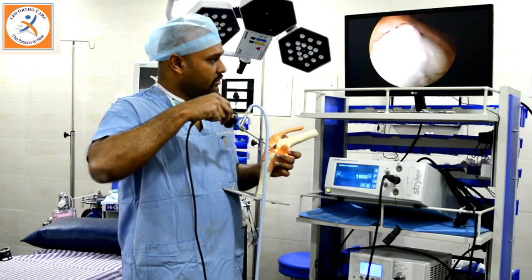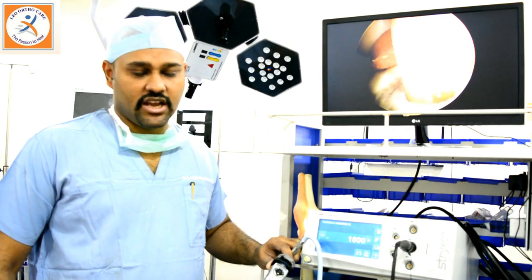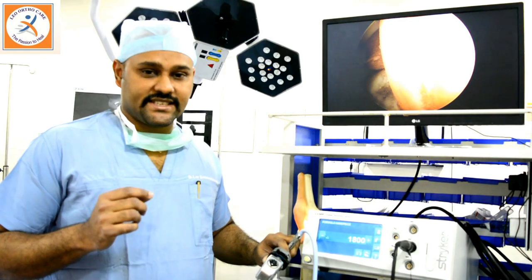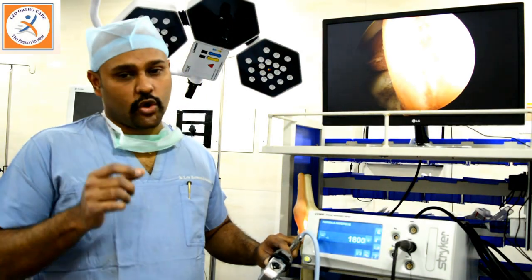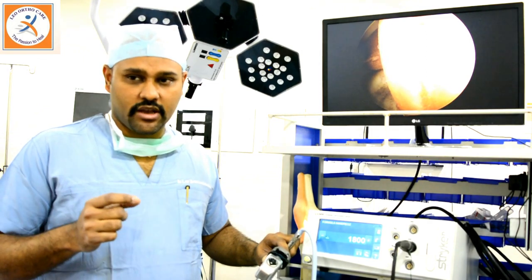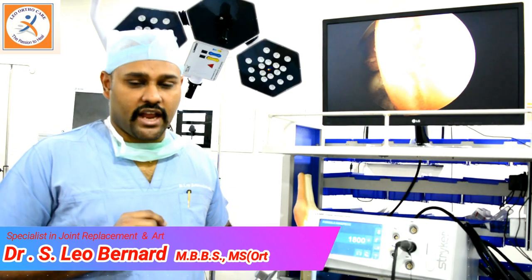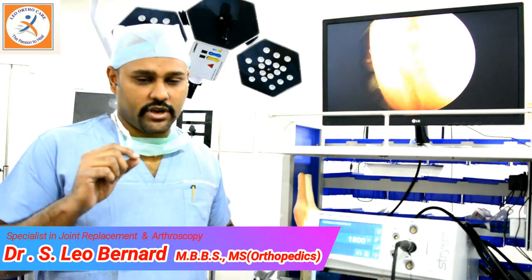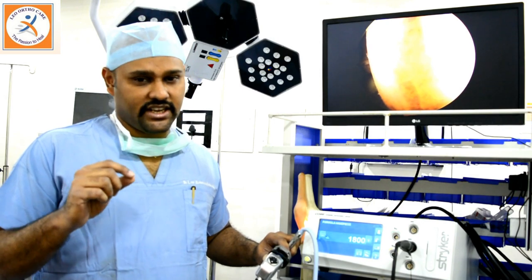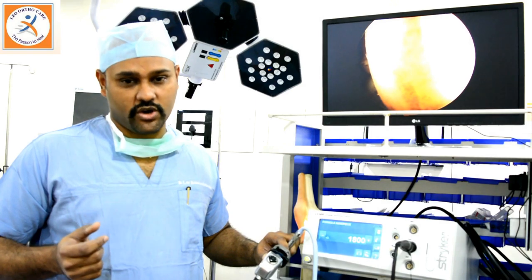Here I am showing you the arthroscopic view of our knee joint on our knee model — this is how the joint will look inside. The first surgery we perform is arthroscopic ACL reconstruction, in which we reconstruct the new anterior cruciate ligament using muscle tendon grafts from inside and around the knee joint. We make holes in the thigh bone and the leg bone and fix it into the joint using screws — either titanium or bioabsorbable screws — which get dissolved in a period of one to one and a half years.